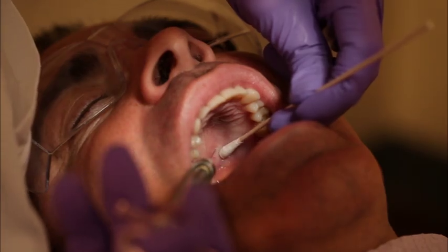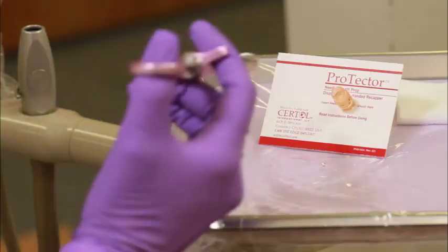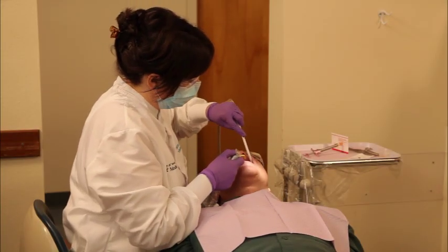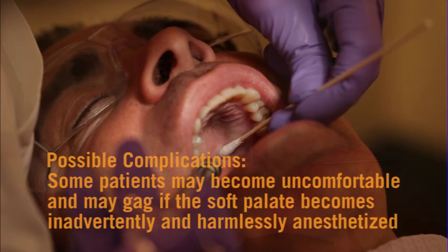Carefully withdraw the syringe and immediately recap the needle using the one-handed scoop method with a needle sheath prop or other recapping device. Rinse the patient's mouth and wait approximately 3 to 5 minutes until the anesthesia takes effect before beginning treatment. Complications from this injection are rare. However, some patients may become uncomfortable and may gag if the soft palate becomes inadvertently and harmlessly anesthetized.